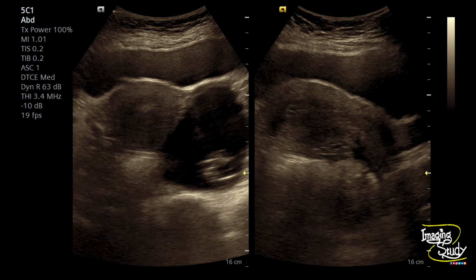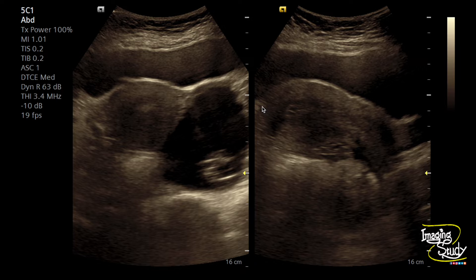Here you can see the transabdominal ultrasound of the pelvic region. You can see the uterus in longitudinal and transverse sections, and a cystic lesion at the left adnexal region with an internal echogenic component.